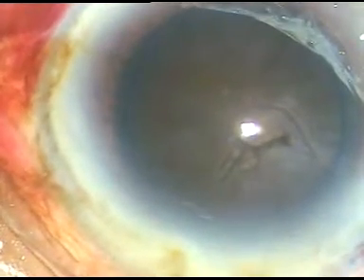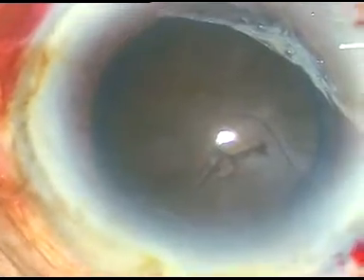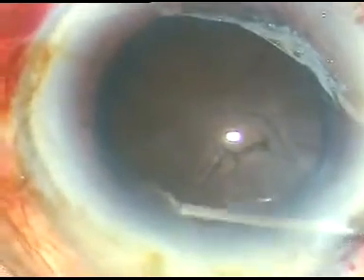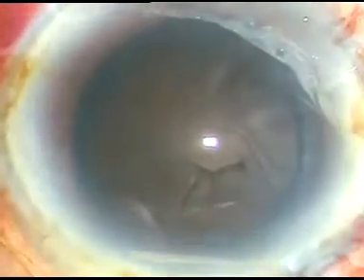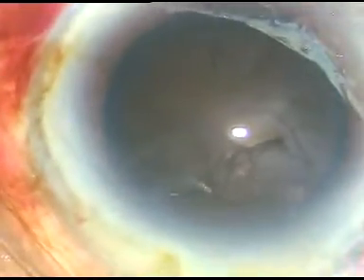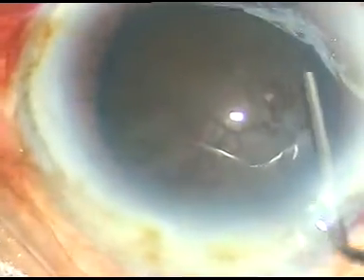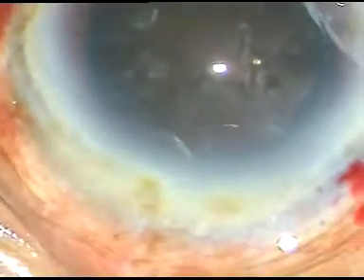You can see that I have made a very large capsulorhexis. The capsulorhexis should be large so that there is no fluid buildup during hydrodissection and during emulsification of the nucleus over the posterior capsule, so that posterior capsule rupture can be prevented. So number 1 is stain the capsule, and number 2 is a large capsulorhexis.